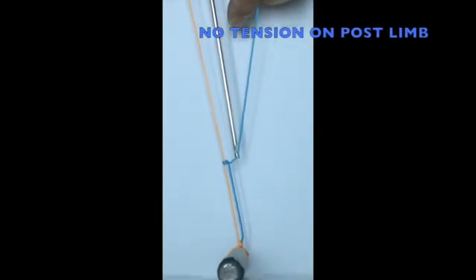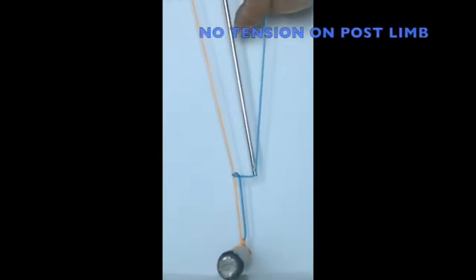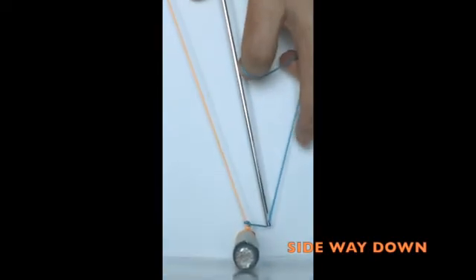This can be avoided by delivering the knot sideways down without tension on the post or the blue limb.